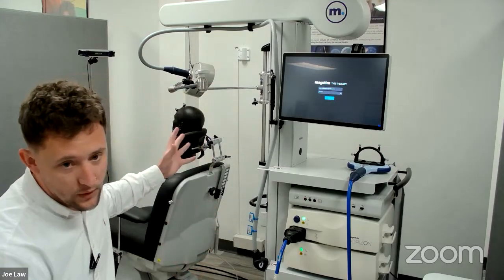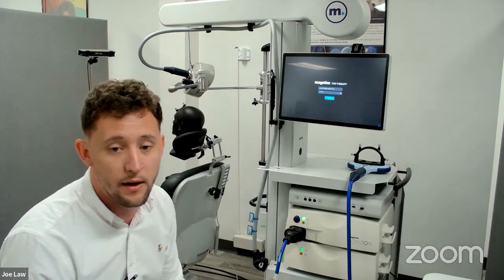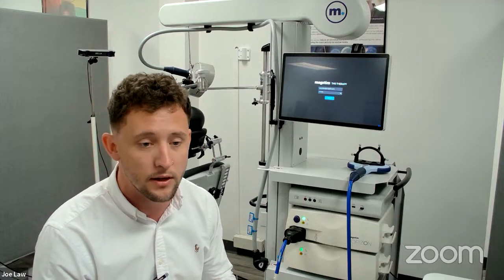Good morning, all. Thank you for joining. Quick introduction. My name is Joe. I am the lead engineer for the US, and I also head the service department in the US. I've worked for Magstim for 13 years, and thank you very much for joining. So what I'd like to do is quickly give an overview of the system, the hardware itself, and then we'll jump into a workflow and go through a full MDD workflow.